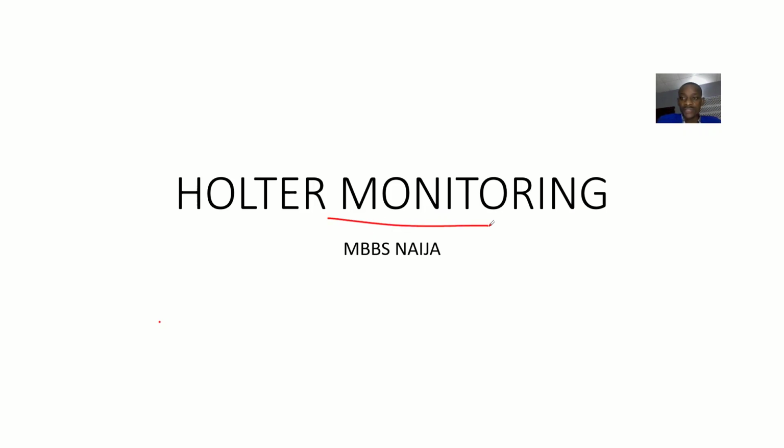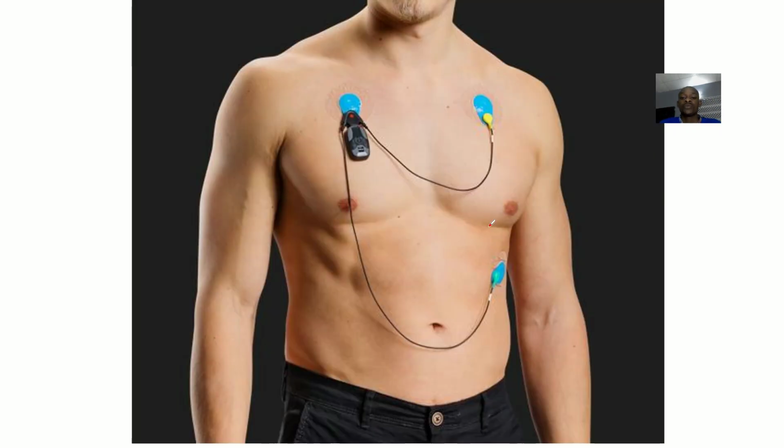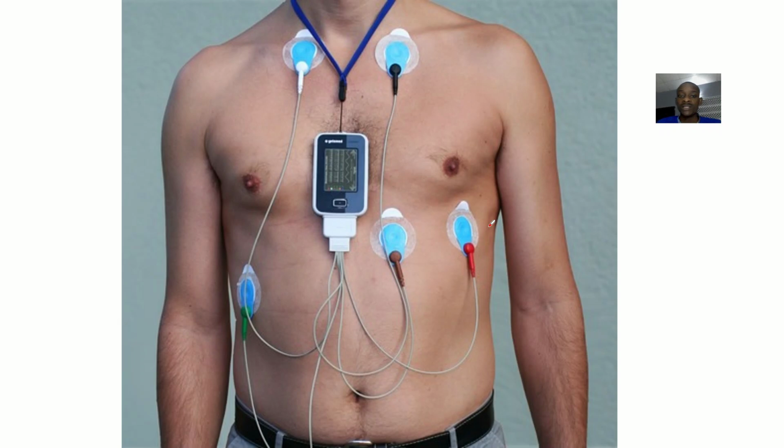So another way of trying to monitor a patient's BP throughout a day is what is known as what? Not really BP, trying to monitor their heart activity. All right. So their heart activity, like you're trying to check out for their heart activities. Another way of doing this is what is known as what? Holter monitoring. Okay. And to me, this Holter monitoring is like a type of what?